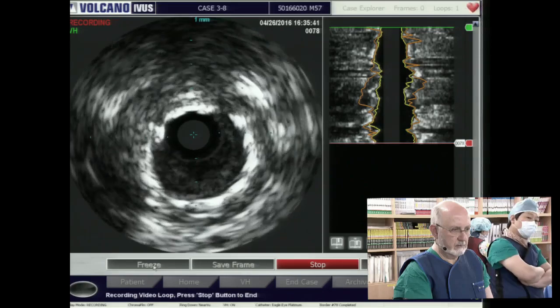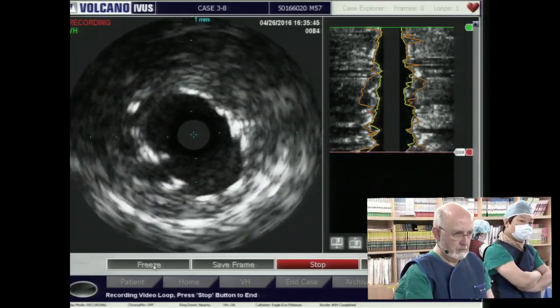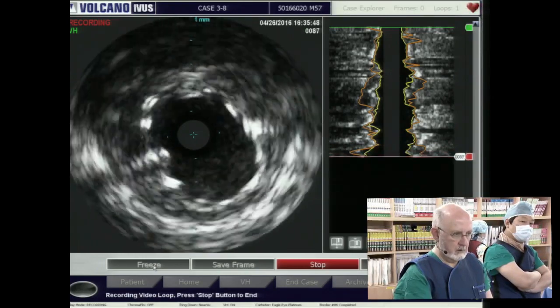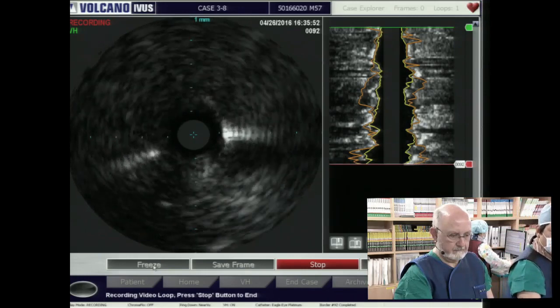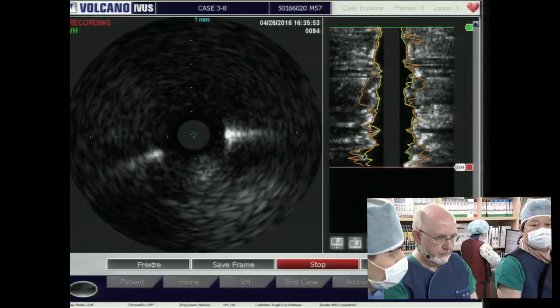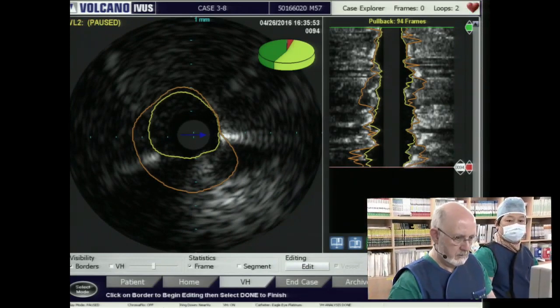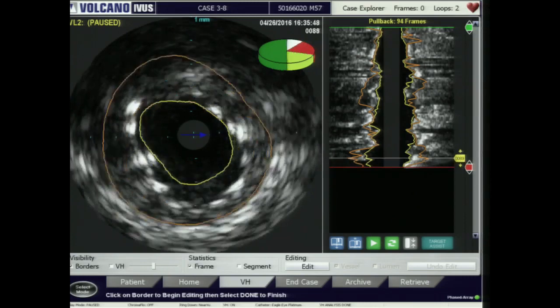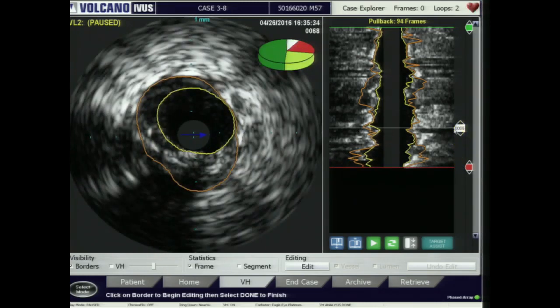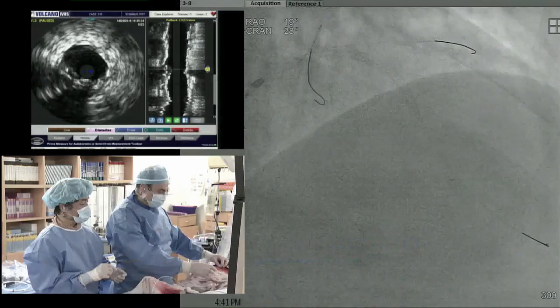Just going to disengage the catheter a little bit and see how poorly I did with the ostium of this left main. Pretty good. Not bad for a rookie, huh? Yep. Alrighty, so do I need to post-dilate right at the diagonal that you have the wire in? 3.5 high pressure or 4.0 high pressure? 3.5. Give us a 3.5 by 20 NC balloon, please.